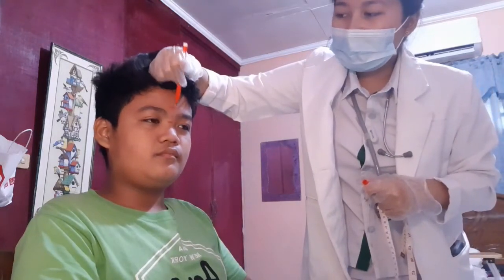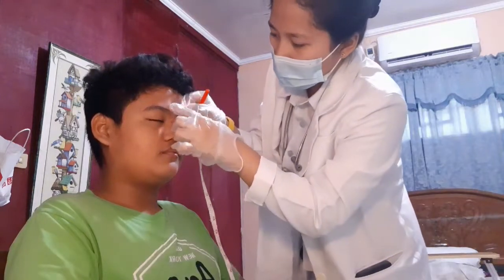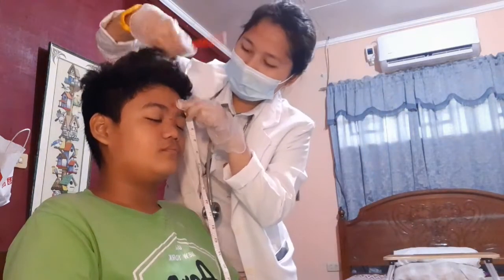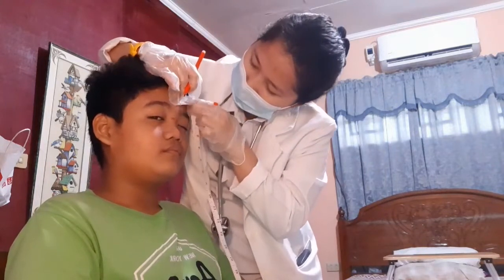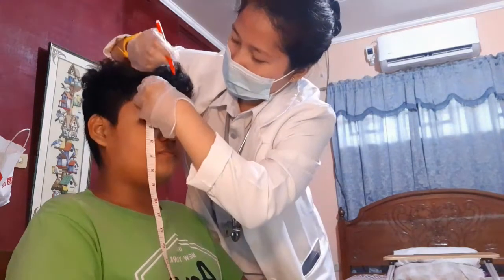Therefore, we will measure it from Fpz to this part and to this part, 2.75, and also on the other side.